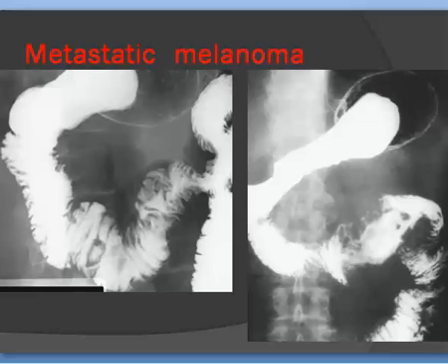In metastatic melanoma, remember the target sign. This is the target sign, a halo zone with barium fleck. It's an ulcerating segment, halo zone with barium inside, and these are the appearances of metastatic melanoma.